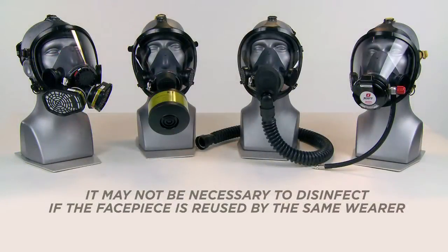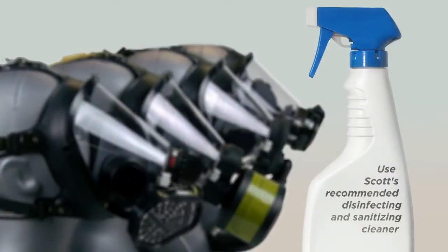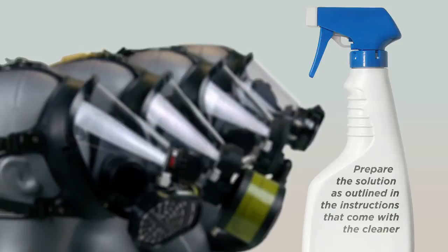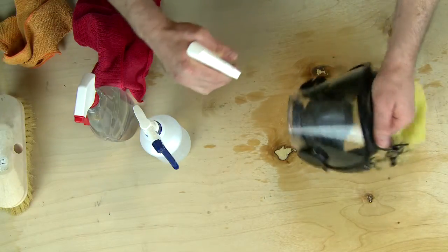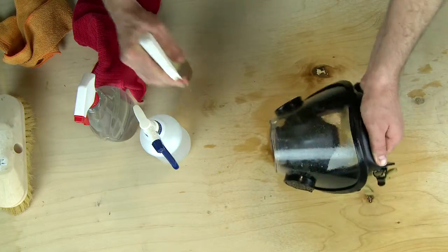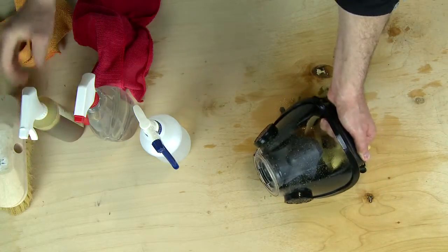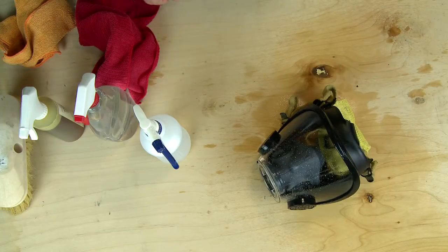It may not be necessary to disinfect the facepiece if reused by the same wearer. Use Scott's recommended disinfecting and sanitizing cleaner. Prepare the disinfecting cleaning solution as outlined in the instructions that come with the cleaner. Disinfect or sanitize the facepiece by spraying three full pumps of the properly diluted disinfectant on the outside of the mask and three full pumps to the inside of the mask, wetting the entire mask including all rubber and plastic areas.